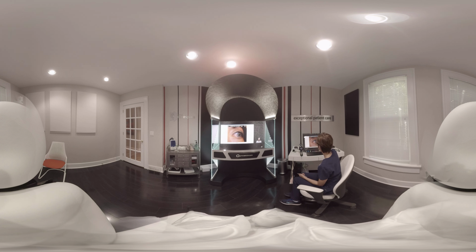We also have a dermatology camera, which allows us to zoom in very closely on skin. This has markings in millimeters, which allows us to measure and keep track of different lesions and save these to the patient's chart. We also have a fundoscope attachment, which allows us to get a very good image of the back of the patient's eye.